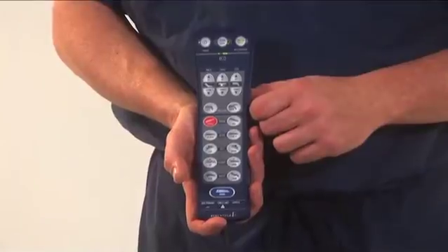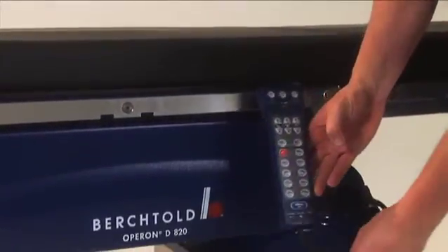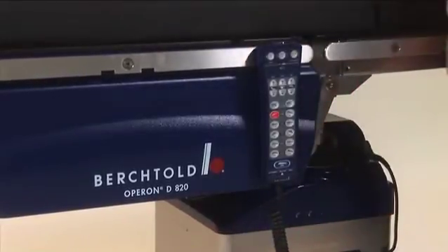The hand pendant for the D820 is fluid impervious for safety. For convenience, the hand pendant clips to the side rail and allows 180 degree rotation. This ensures the clip will not be damaged when the hand pendant is pulled away from the table.